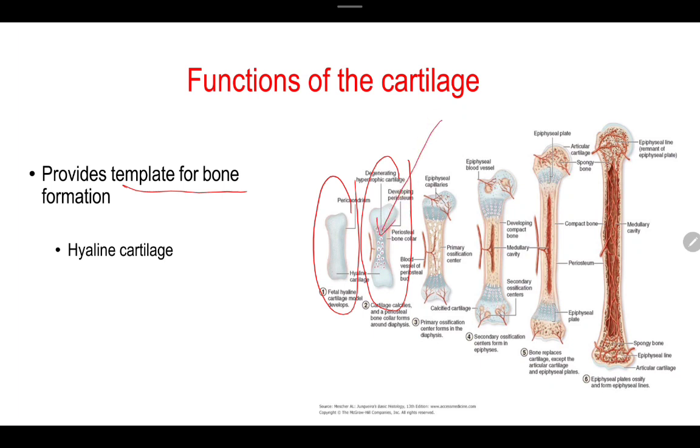As we get older, ready to be born, yung ating mga cartilage dyan, guys, will be infiltrated by blood vessels, particularly the hyaline cartilage. So pag tinanong kayo anong klaseng cartilage ang meron when we are still developing fetuses, hyaline cartilage.